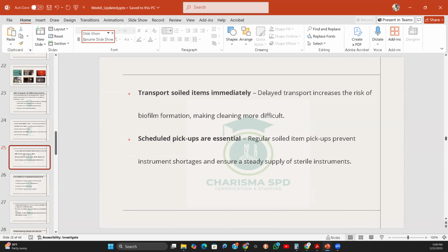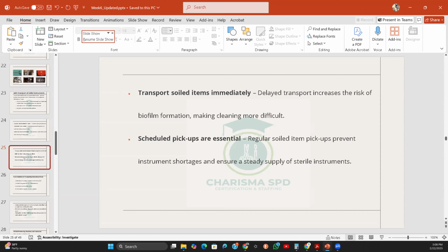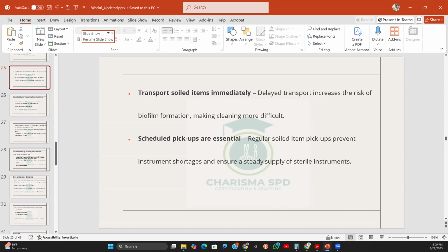Okay, so it means that every instrument comes from a certain basket. That basket, we have to keep the instruments all together in that basket. And that basket goes into a box. That box has filters, it has locks. All of it is supposed to maintain sterility of the environment. And when the lock is broken, the tray is no more sterile.